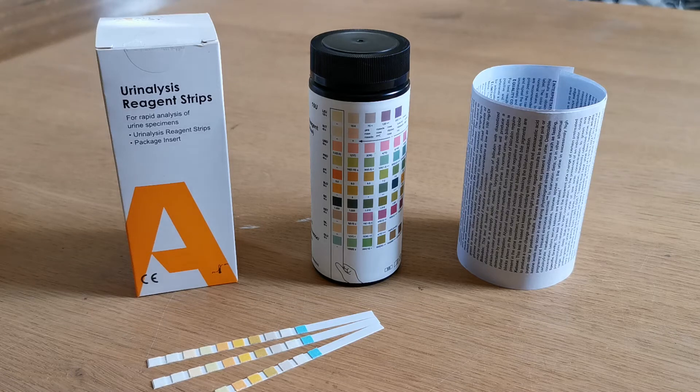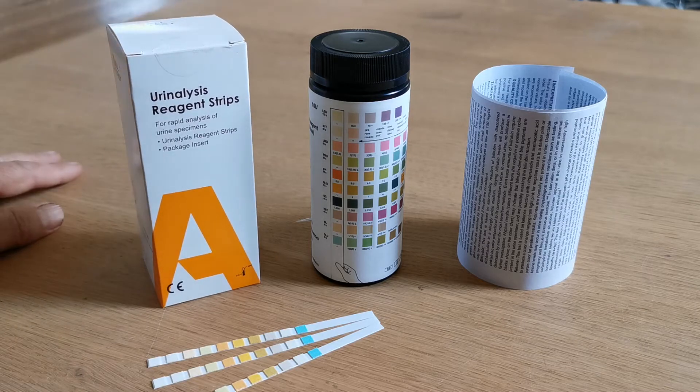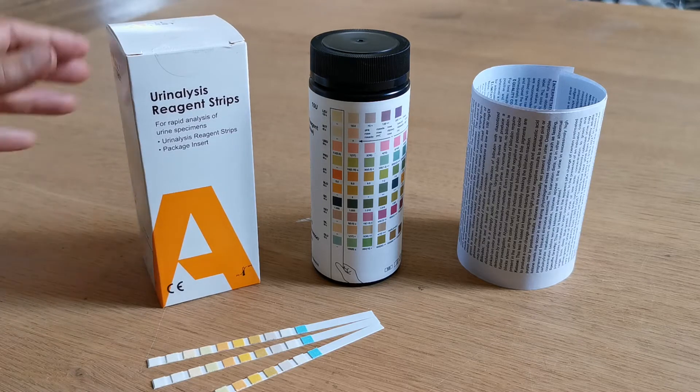Welcome to this Valumed presentation where we're going to show you the AllTest URS 10U. This is a urine testing strip packed by AllTest, which is one of the leading biotech manufacturers globally.